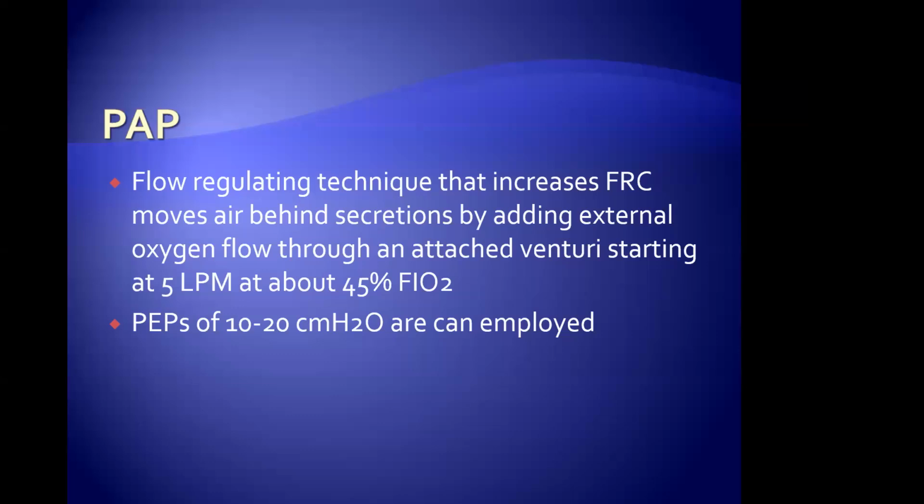Again, PAP devices are a big deal. And the cool thing about this is it goes through a Venturi, so I know what my patient's FiO2 is. While they're doing that, I know what their FiO2 is, and I know where I'm at increasing FRC.